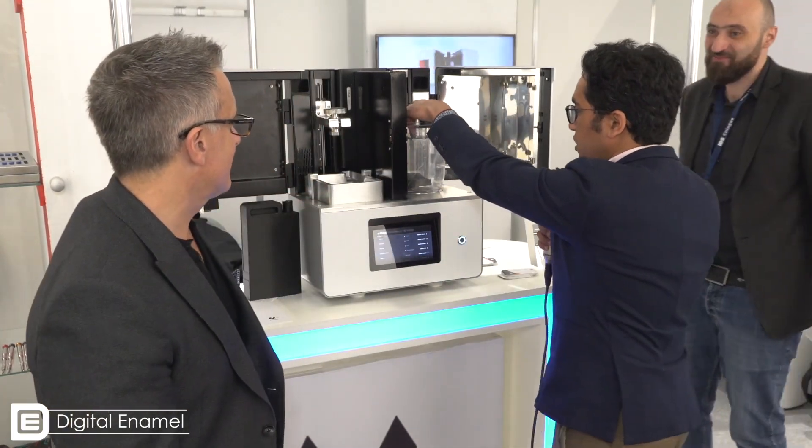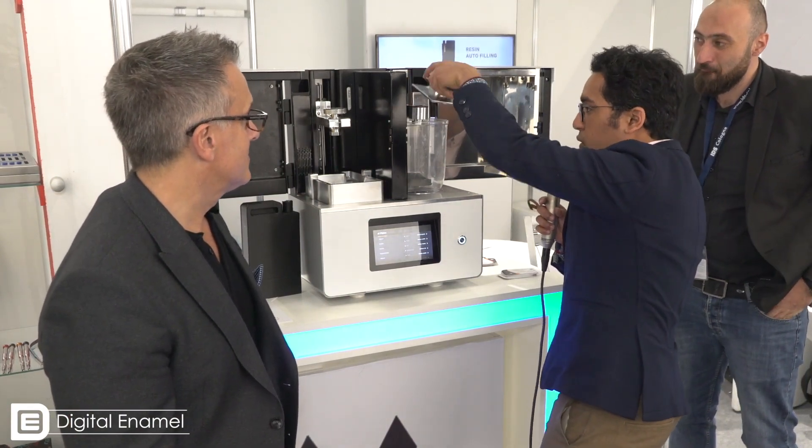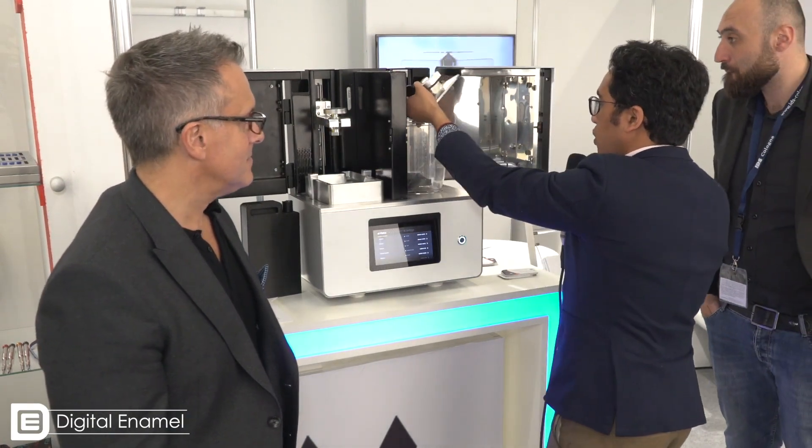It's a desktop machine which integrates the whole dental workflow. It starts from here, getting the building platform, and moving to the washing part.